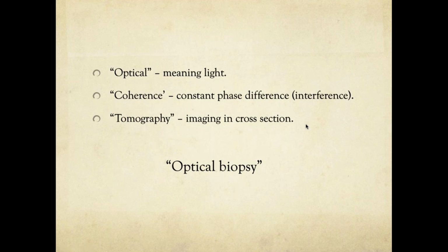So since that can be detected without any invasive procedure, because if you want to see if it was really a microaneurysm or not, if you did not have an OCT, the only other way was to take out a piece or a small tissue of the retina and examine it under the microscope. But since we don't need to do that, it's basically optical biopsy.